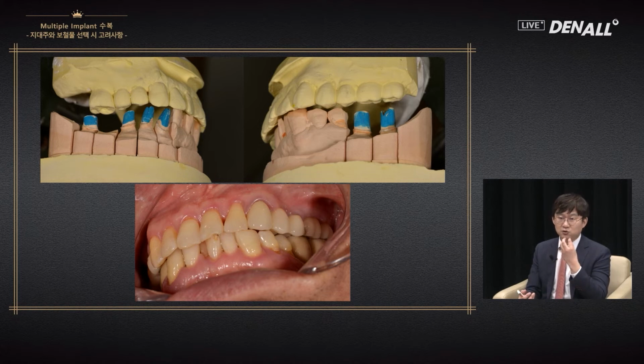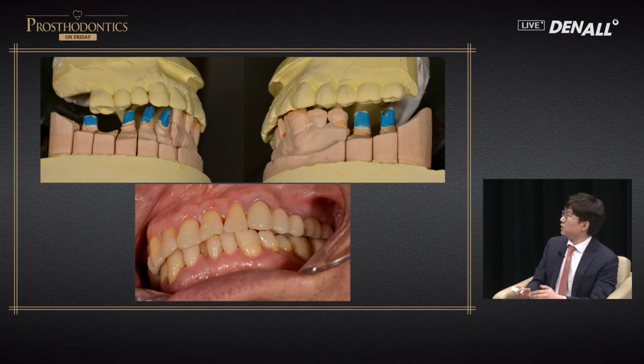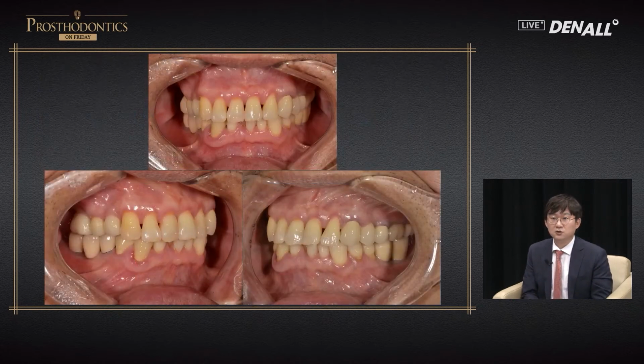If it is not due to the perio problem, but simply because of the stretched PDL, if the support for the occlusion is provided, the mobility would disappear in many cases. In this case, the fremitus is avoided and temporary is provided. Adjustment to it is observed before final prosthesis. After a year, anterior region is stabilized and it is very well used.